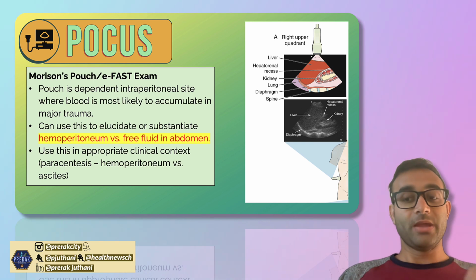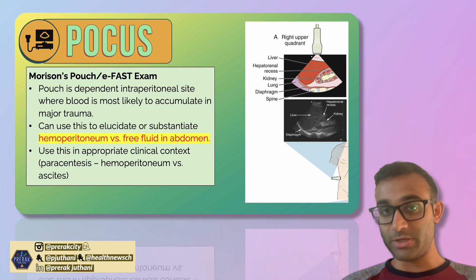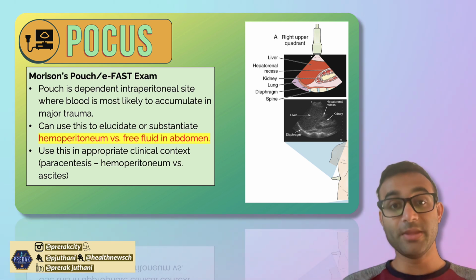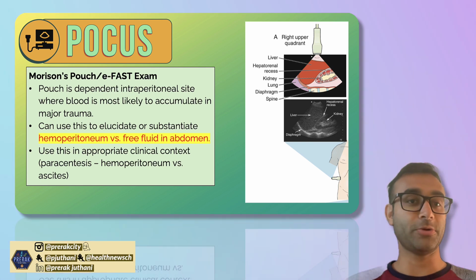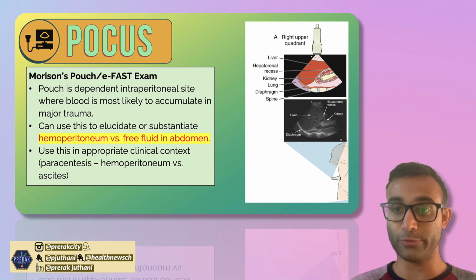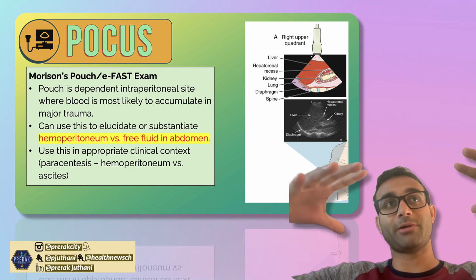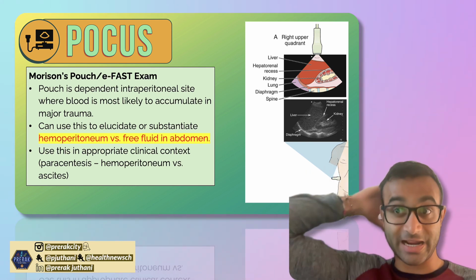With that being said, how exactly can we use the abdominal ultrasound when someone has hypotension? Let's say someone has hypotension and you're worried about something in the belly. One of the biggest causes of hypotension can be bleeding. It can also be if something is being lost into the peritoneal space. If fluid is accumulating there, you can often have increased intra-abdominal pressure, which then compresses the IVC and leads to decreased preload and then also leads to hypotension.